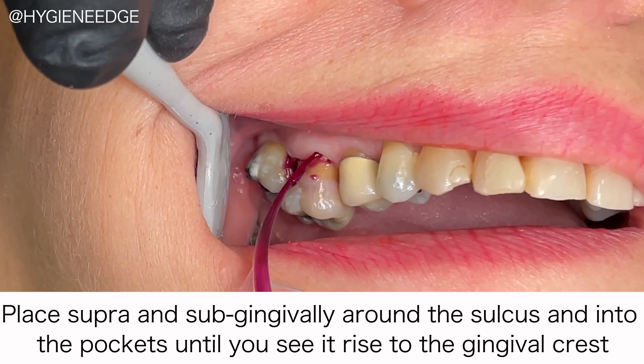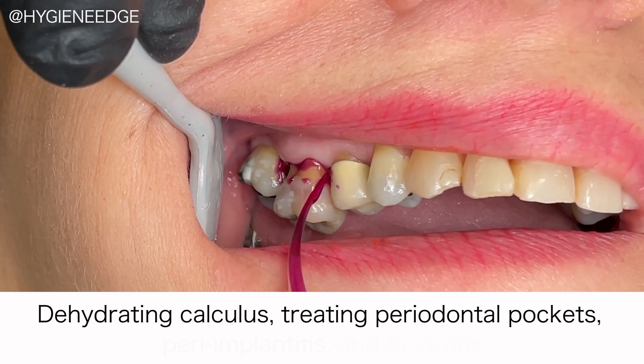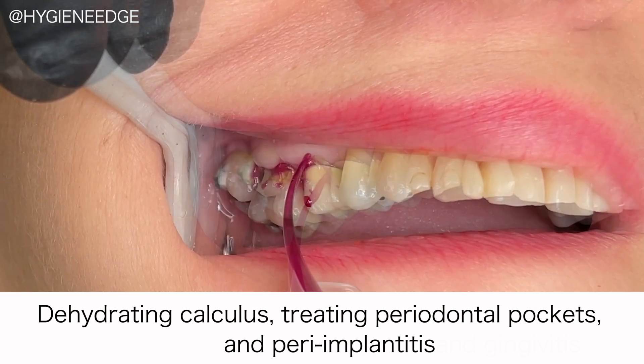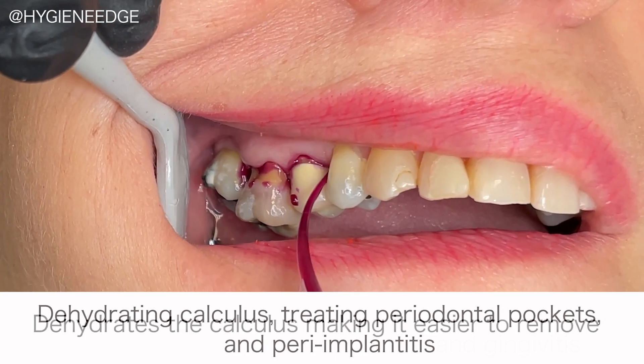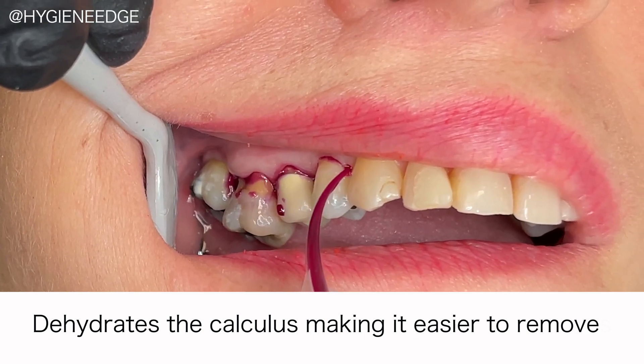It can be used both pre- and post-scaling for a variety of treatment situations like dehydrating the calculus, treating periodontally diseased pockets, and peri-implantitis. Hybenex can flow into the threads of an implant, removing the bacteria and reducing the chance of peri-implantitis. Here we're using it pre-scaling to dehydrate the calculus, making it easier to remove.